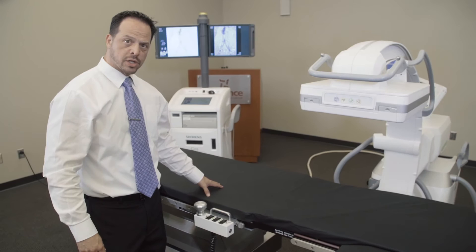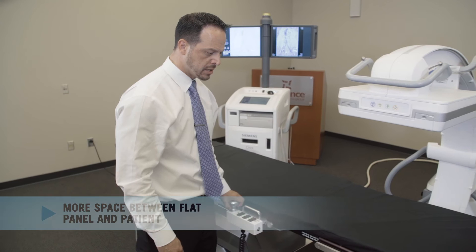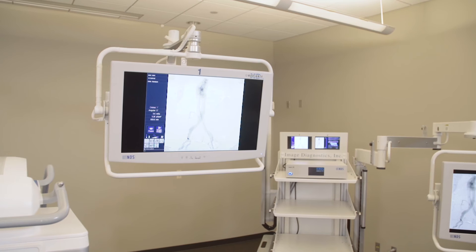Here is our IDI vascular table. It's got a floating top — just a little bit of a lift of the lever here and we've got full floating function. This way you don't have to move the C-Arm up and down the patient. At the touch of this joystick here, we'll be able to control the whole table top: up, down, Trendelenburg — every single movement you can think of on a table, this table will provide for you.